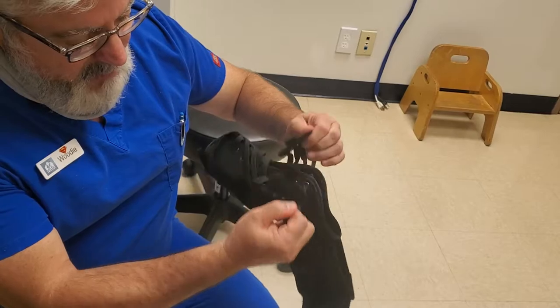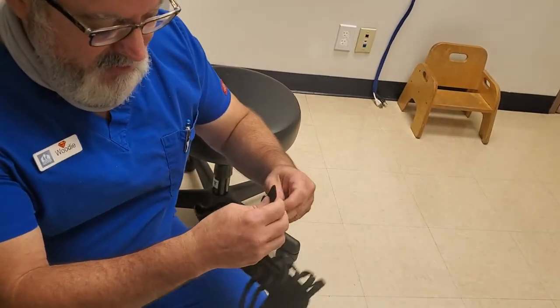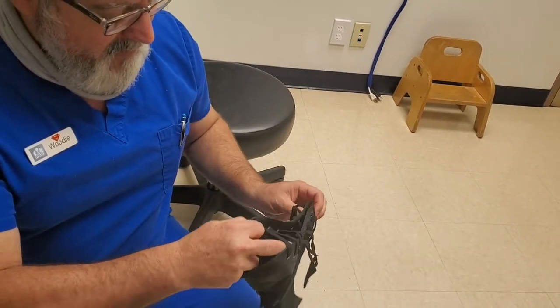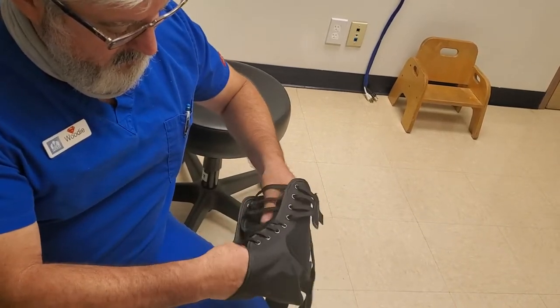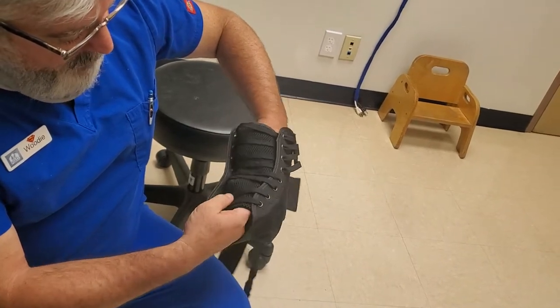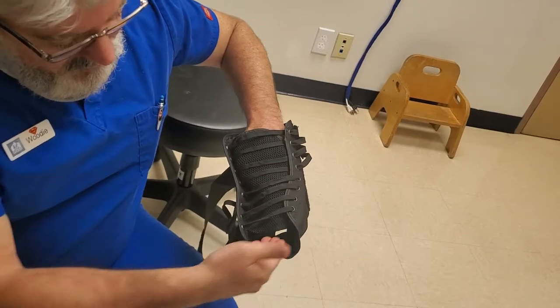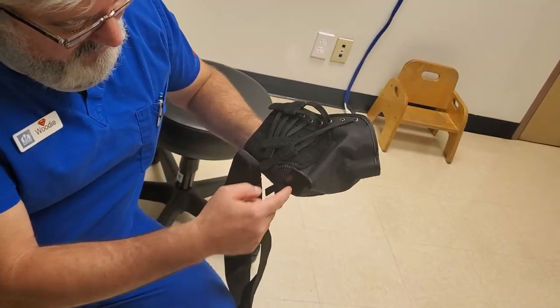It is called a lace-up brace, but to be honest with you, you don't really do any tying as much as you do velcro. We're going to open up the entire thing all the way, and when you open it all the way and present it to your patient it should look similar to a high top or quarter top shoe presentation from the front — the tongue, the laces, etc. The toes will come out the front end and the little hole back here is for the heel to stick out of.